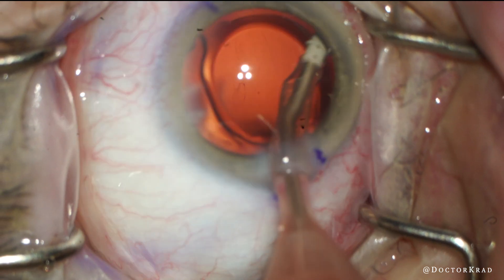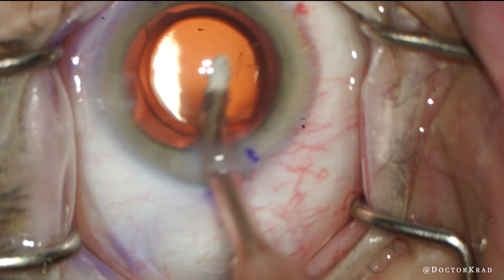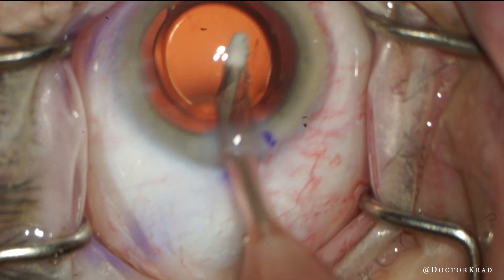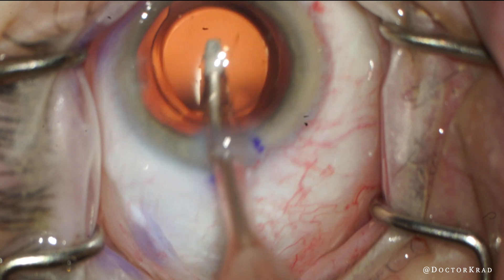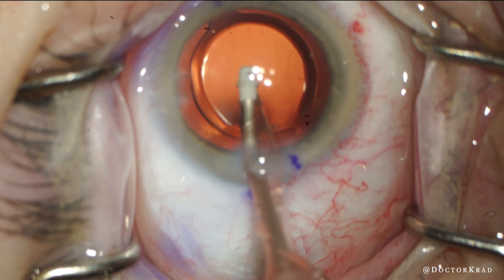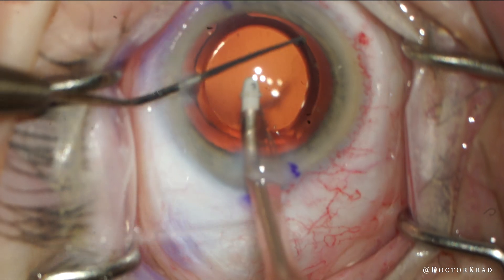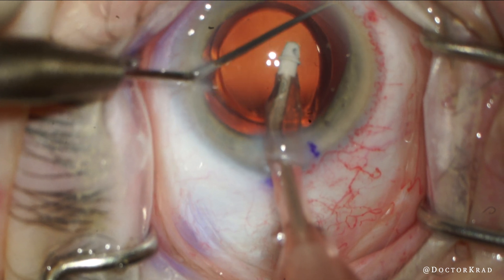So I very gently aspirate in this area to see if I catch something, but I don't see anything. Nothing is showing up, so at this point I want you to take a look at the rest of the eye — do you see anything unusual? I'm going to check behind the iris, so I asked for a Kuglen hook, and still nothing to be found.